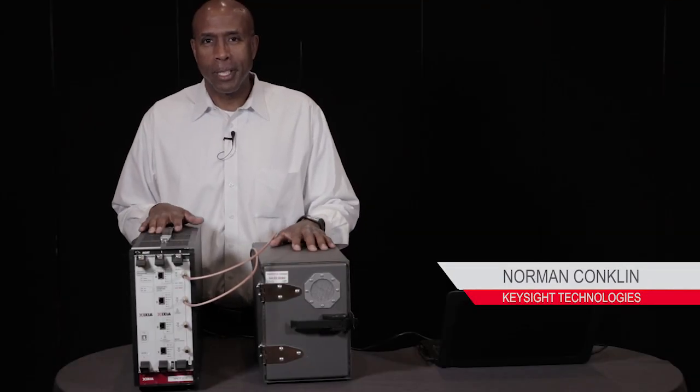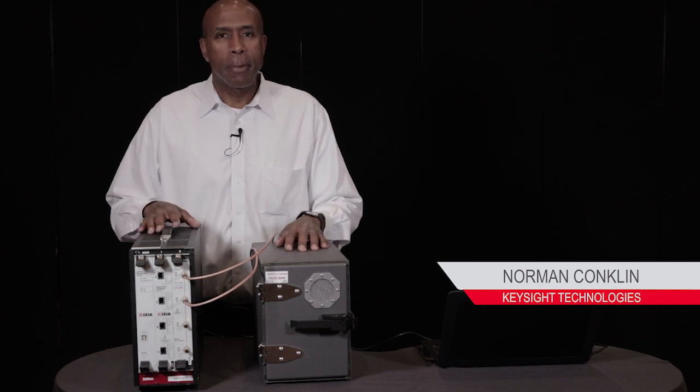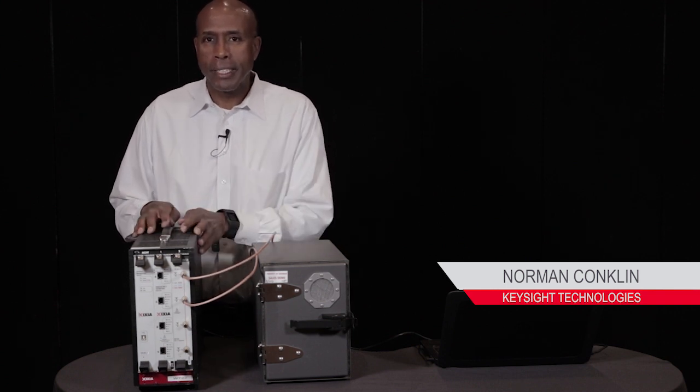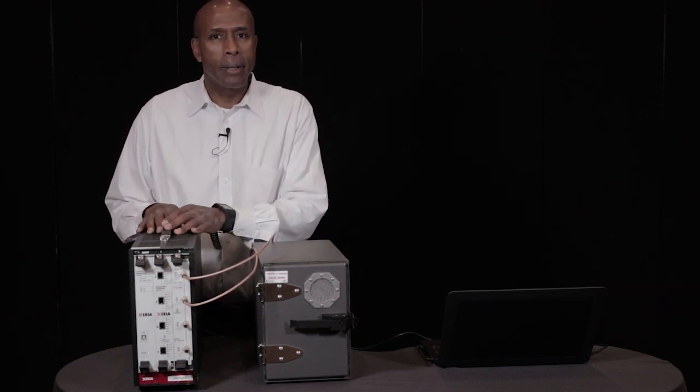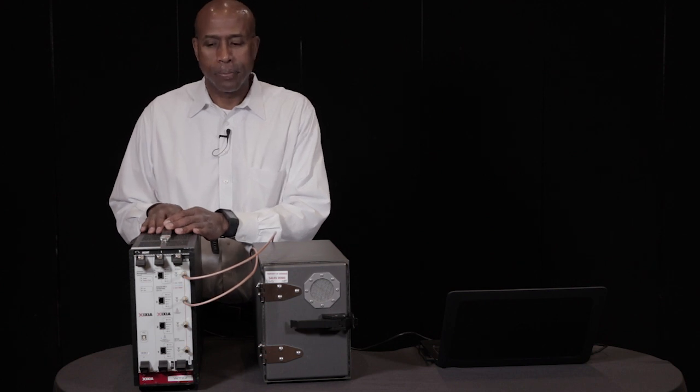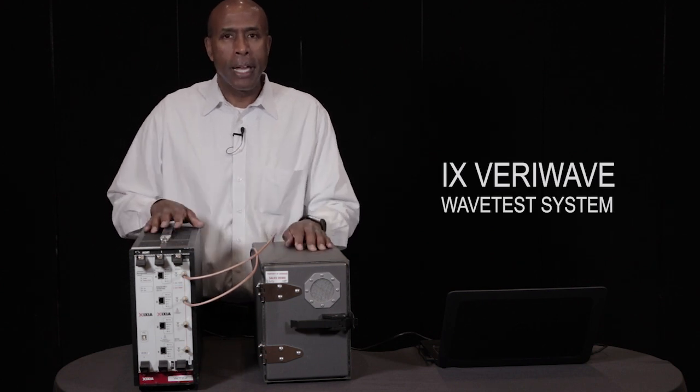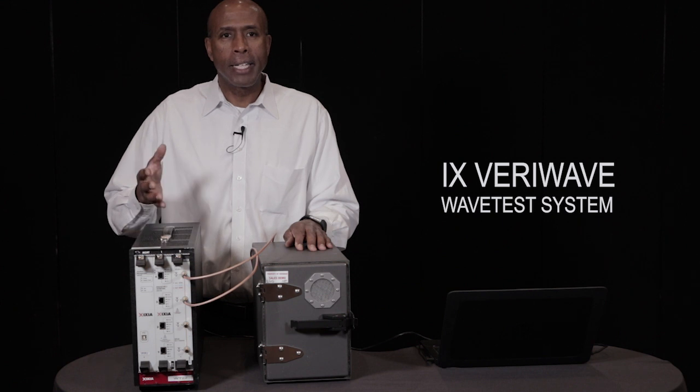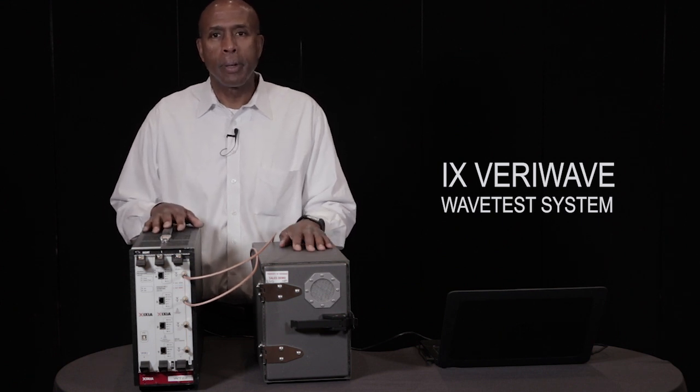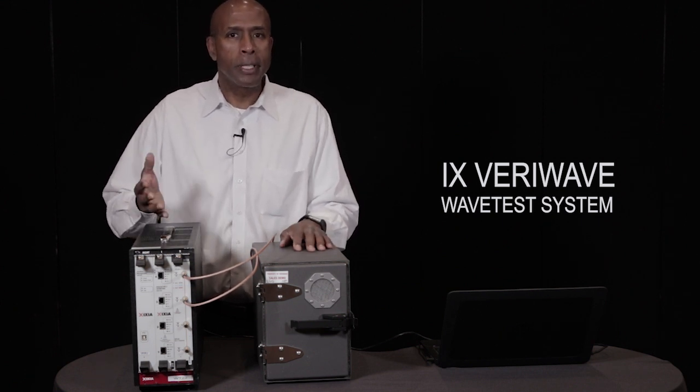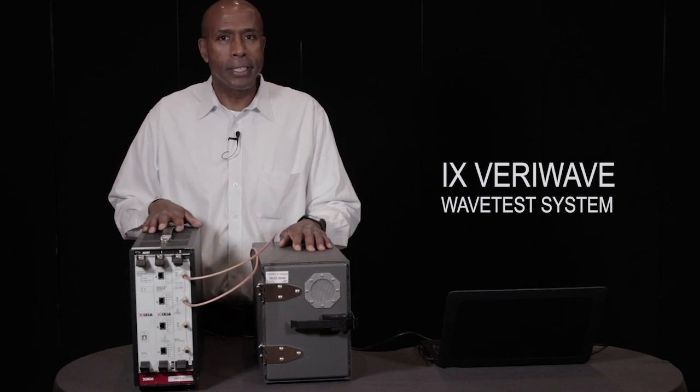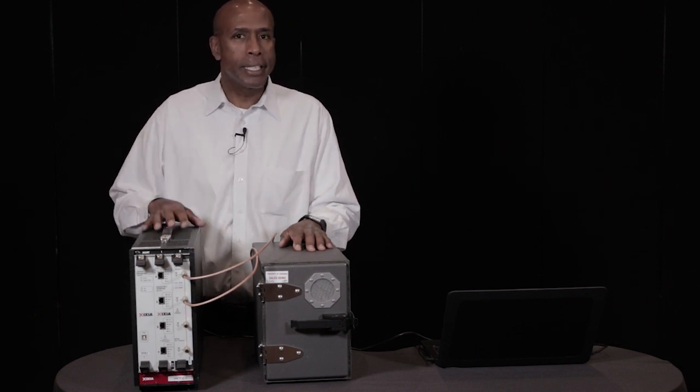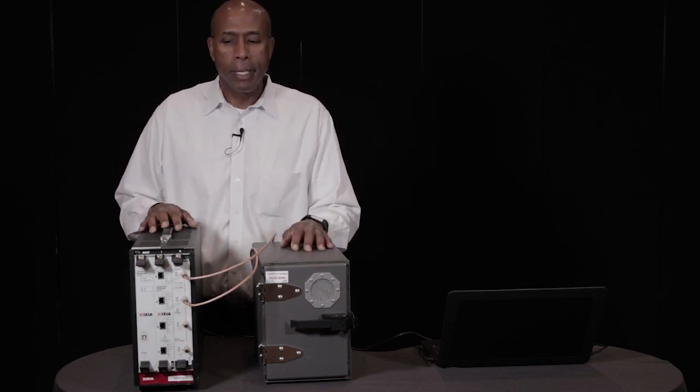My name is Norman Conklin and today I'm going to cover medical device testing using the iX VeriWave from Keysight. The iX VeriWave wave test system provides wireless testing of infrastructure for hospitals as well as medical devices. Today we're going to test a medical device.